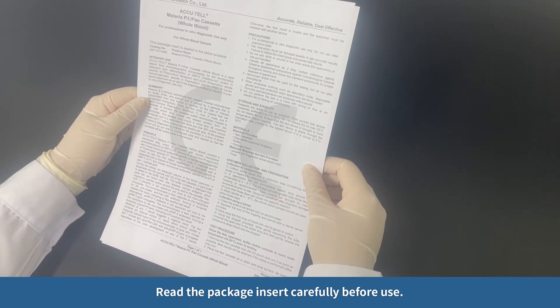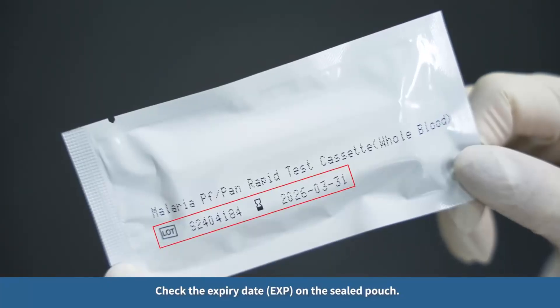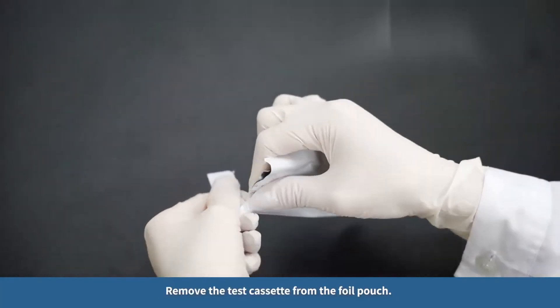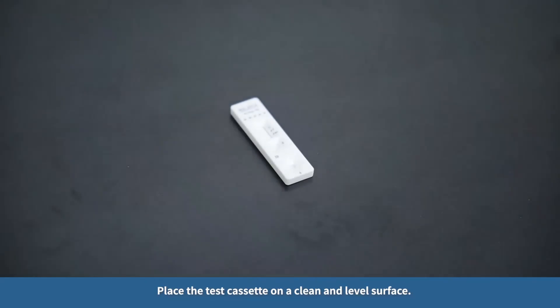Read the package insert carefully before use. Check the expiry date (EXP) on the sealed pouch. Remove the test cassette from the foil pouch and place the test cassette on a clean and level surface.